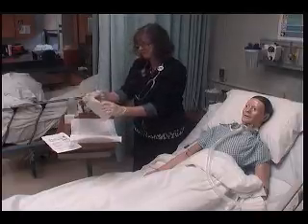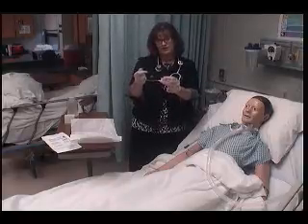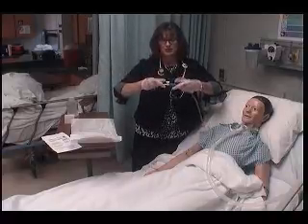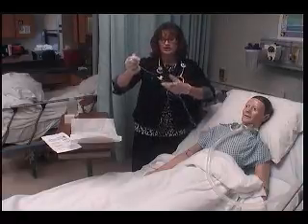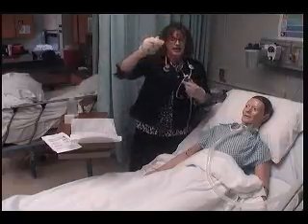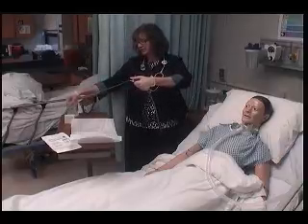Now I'm going to pick up my catheter. While I have two sterile hands, I'm going to hold it — I'm right-handed so I'll put it in my right hand — and keep everything sterile while I connect. I hold it here, reach over and connect, being careful not to contaminate. Put it on tight enough so it doesn't come undone. From the point where I touched the tubing this way it's not sterile; from the catheter tip this way I'm sterile. I'm going to go ahead and lubricate my catheter and test the suction by putting my thumb over the opening.